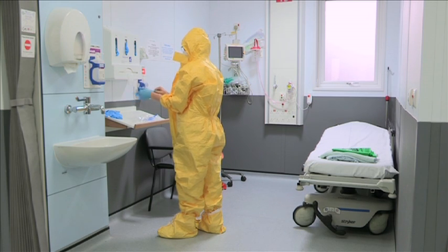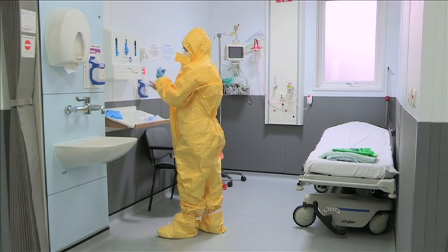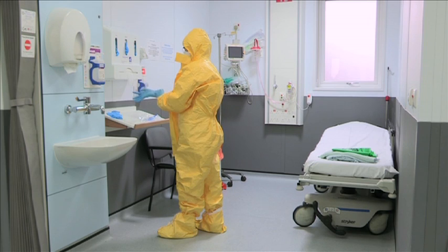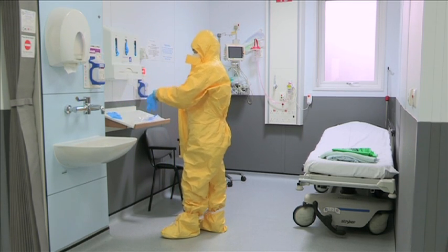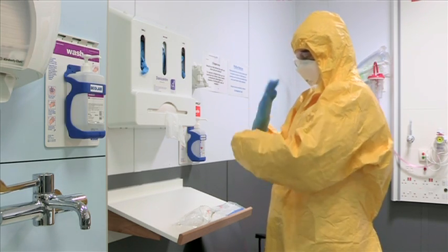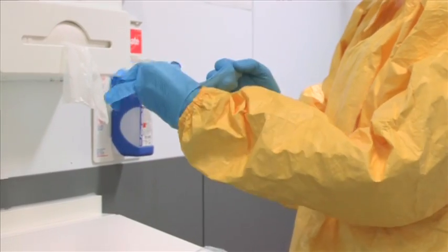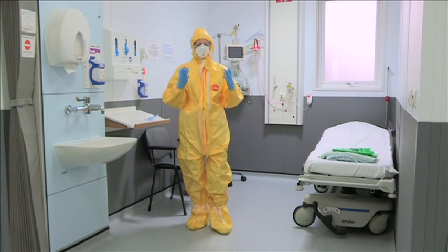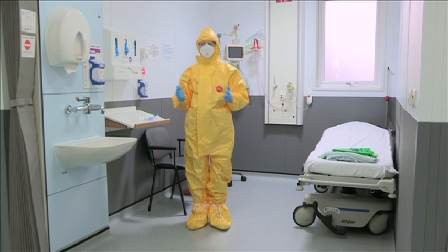Apply two pairs of gloves. The first pair is put on with the cuffs underneath the cuffs of the suit. The second pair of gloves is applied with the cuffs over the cuffs of the suit. Finally, ensure all personal protective equipment is secure and intact before entering the room to care for the patient.